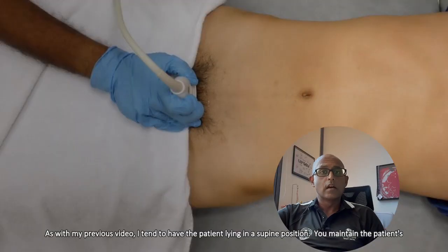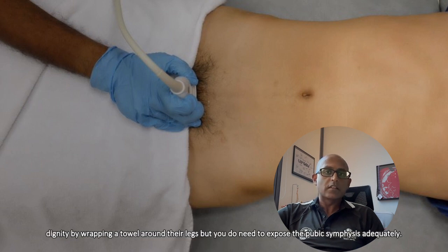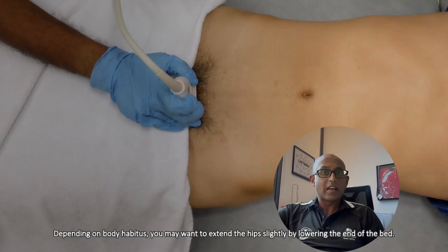As with my previous video, I tend to have the patient lying in a supine position. You maintain the patient's dignity by wrapping a towel around their legs, but you do need to expose the pubic symphysis adequately. Depending on body habitus, you may want to extend the hips slightly by lowering the end of the bed.